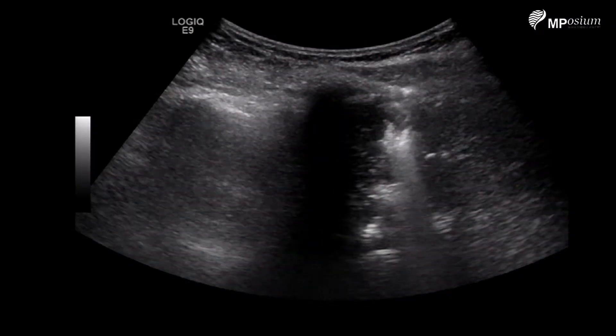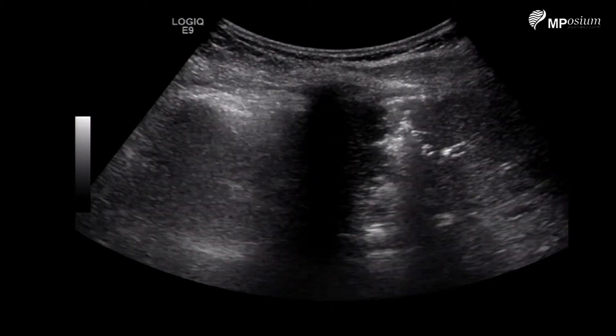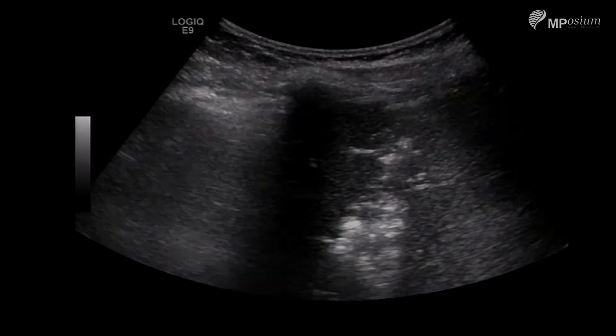I'm going to change my angle of view. You can see my needle, which is below the liver capsule. I'm still tract ablating, and I've now reached the capsule — the system has stopped tract ablation.